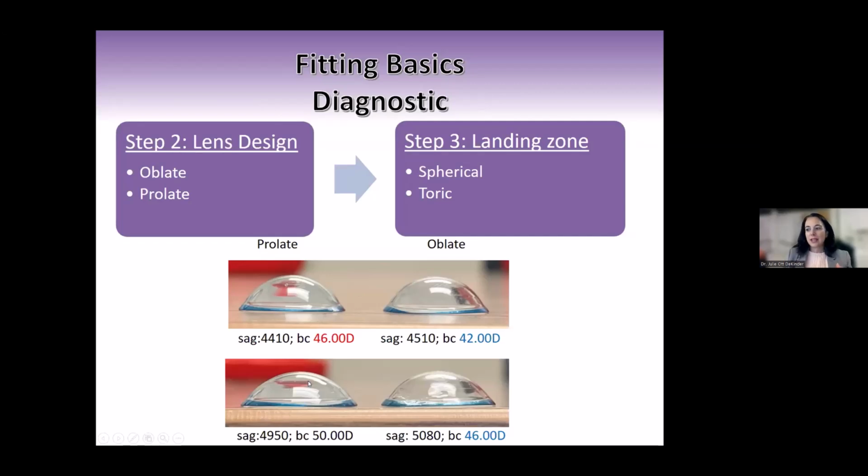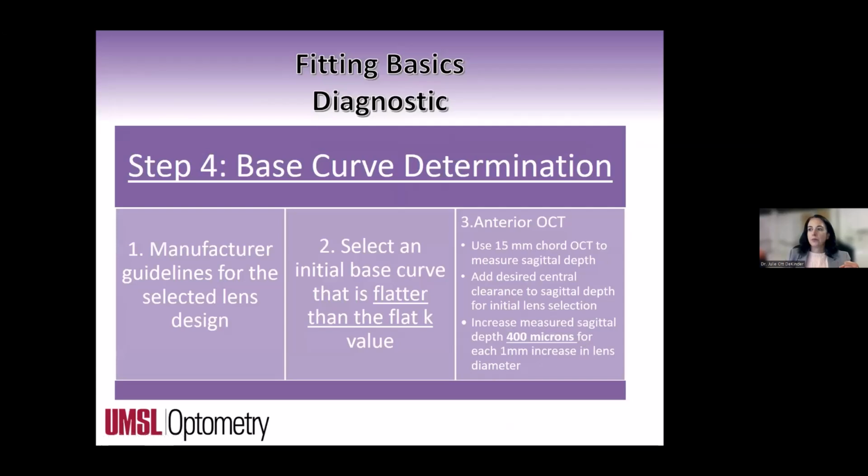Same thing here, almost identical sag, but incredibly different, 50 down to a 46 on your base curve. So just something interesting to look at there. Base curve determination. How do we pick our base curve?